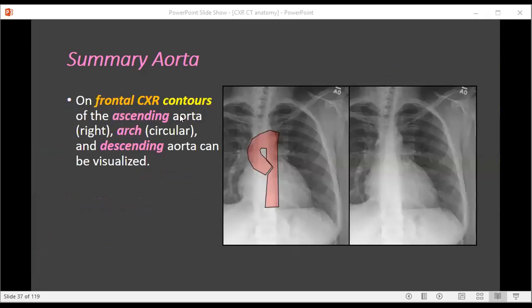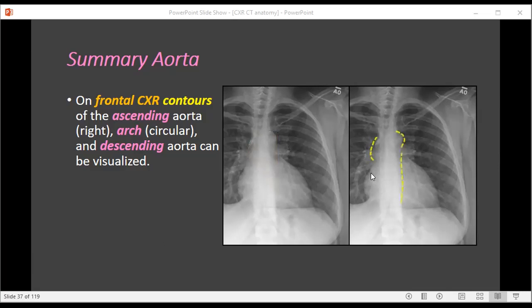On a frontal chest X-ray, we can see portions of the ascending aorta — not all of its outline, but portions — as well as portions of the aortic arch and the descending thoracic aorta.